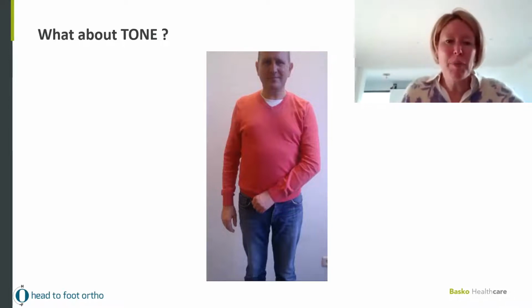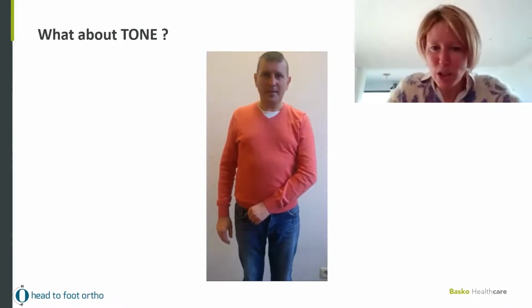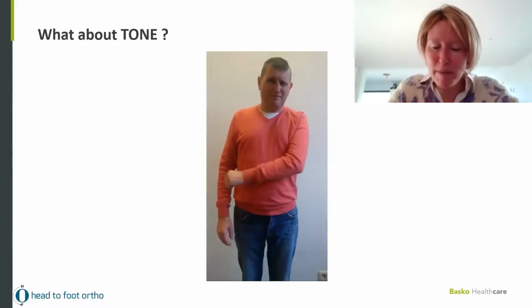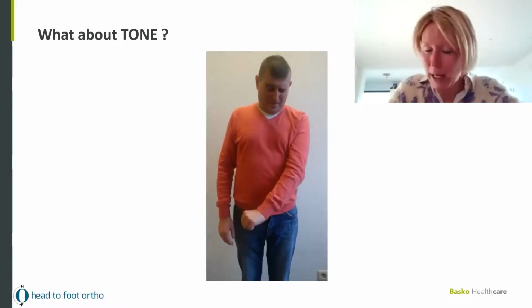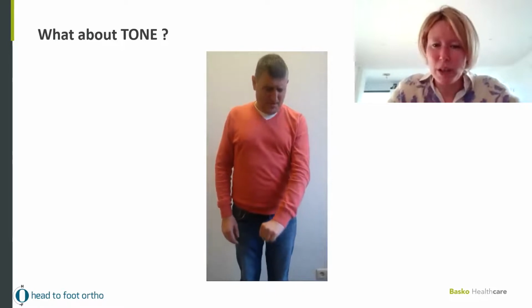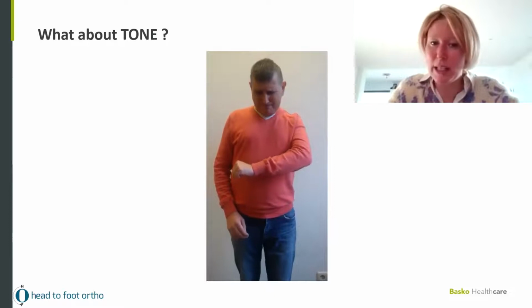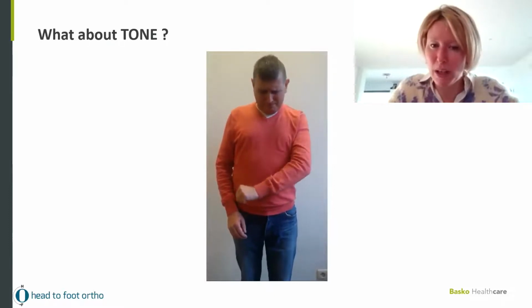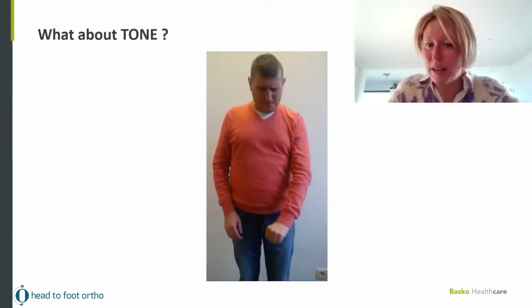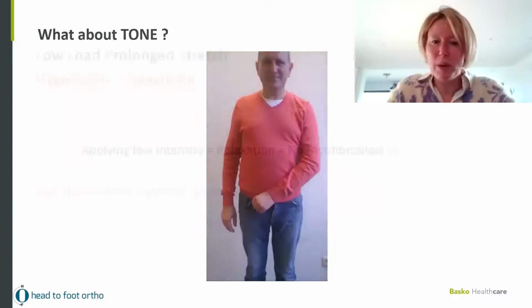So what happens? You can see here my Michelle. And Michelle is struggling with tone after a CVA. A lot of tone and a lot of pain. He really was in pain. And the first question from the doctor was, can you offer something to him during the night not to be in that flexion pattern all the time? So I would say, well, you know, I do have testing devices. Maybe we can try. Well, we see when we apply.